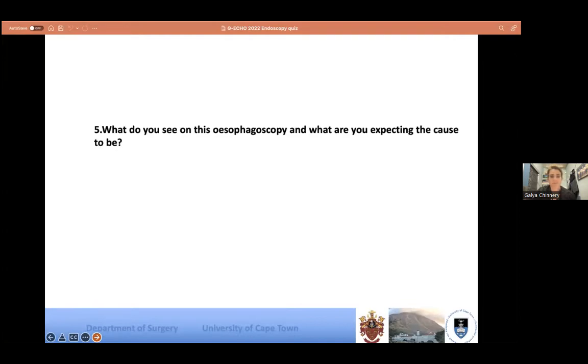Right. Okay. Can I ask a question, Gally? Yes, please. So obviously we're not quite sure what the pathology is here. You didn't tell us what the pathology is. No. Do you have a tissue diagnosis? It was TB. It was tuberculosis.